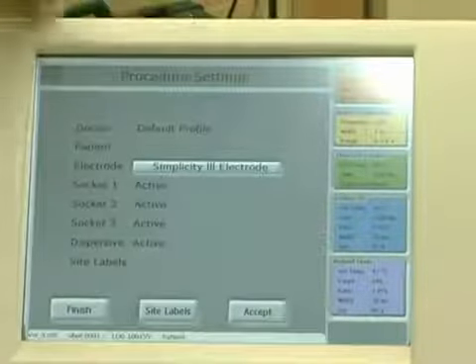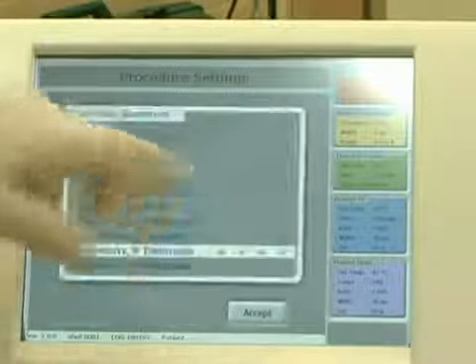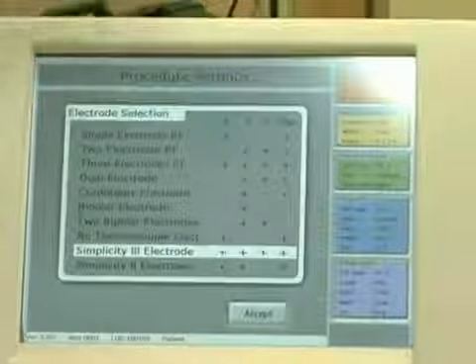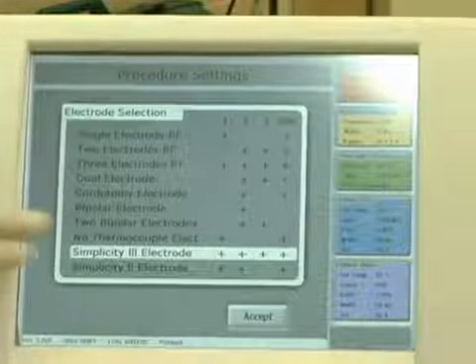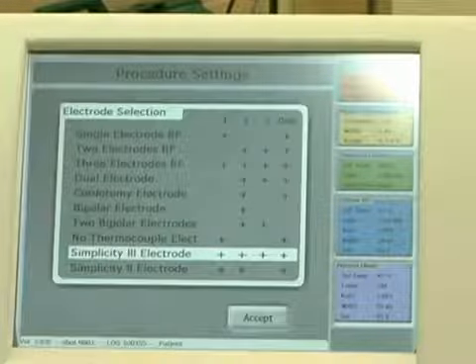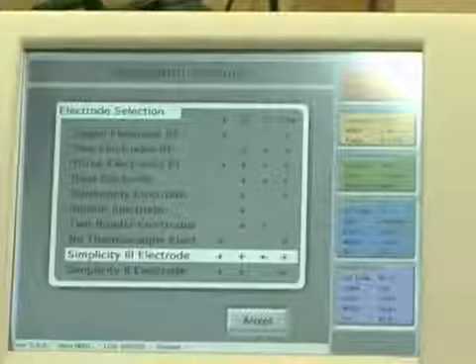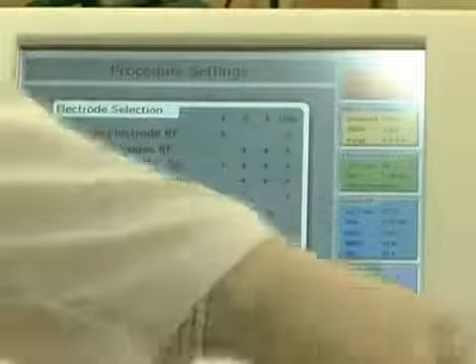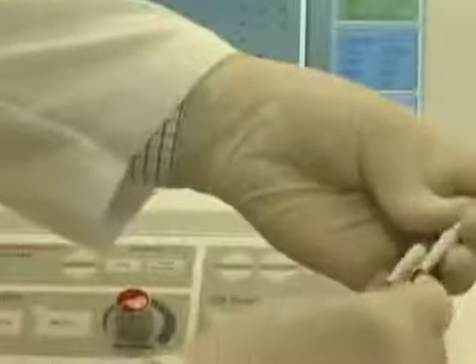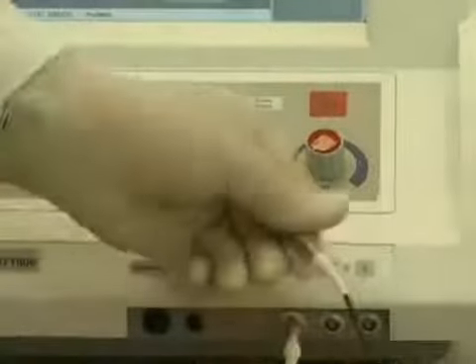The procedure settings screen allows you to choose what type of procedure you'll actually be doing. By pressing the electrode button here, you can see that there are many options. You can choose single, double, triple, dual electrode, but today I'm going to be focusing on the last two, which are specific to the Simplicity electrode, Simplicity 3 and Simplicity 2. In order to connect up the Simplicity probe, you simply take the interconnection cable, which is labeled 1, 2, and 3, and plug it into the associated 1, 2, and 3 inputs of the NT1100 system.